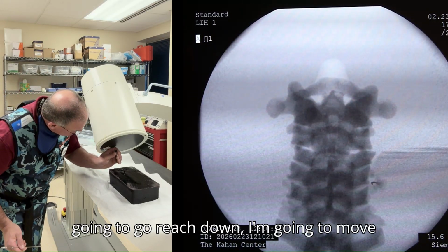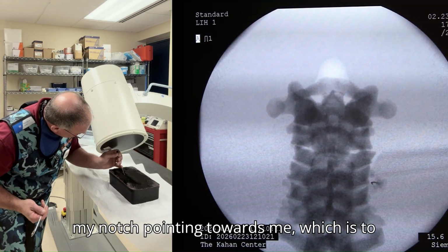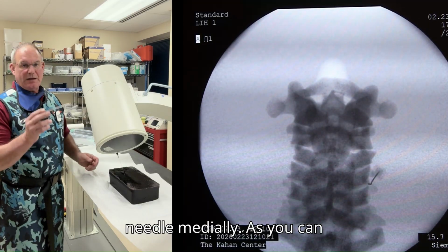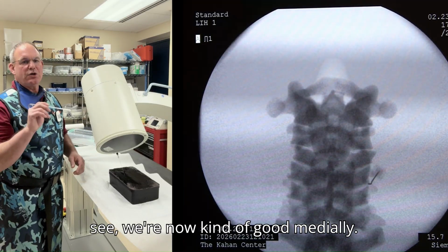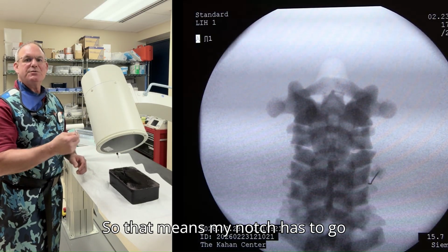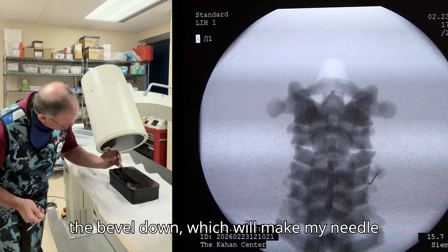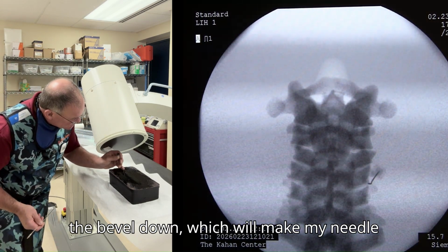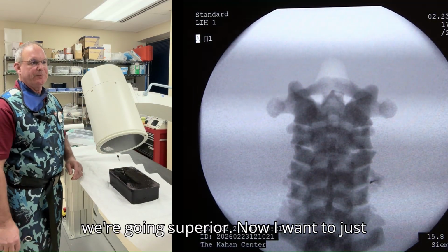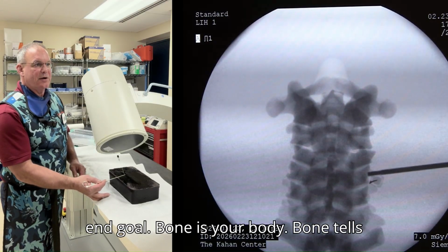So I'm going to go reach down. I'm going to move my notch pointing towards me, which is to the right. And that should direct my needle medially, as you can see. We're now kind of good medially. We're now going to direct it up superior. So that means my notch has to go down towards the feet, which will point the bevel down, which will make my needle go superior. And we're going superior.